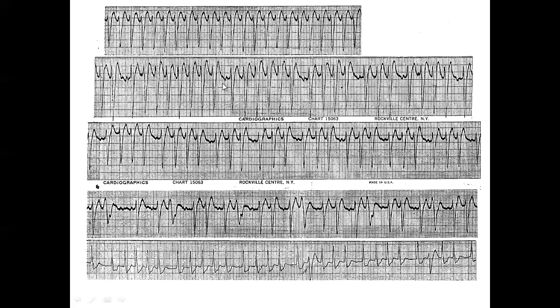It can do it for 6 beats, but couldn't do it anymore. It could do it for 4 beats and couldn't do it anymore. And it's manifesting as a Wenckebach phenomenon, and we can call it Wenckebach phenomenon because of the two earmarks. That is, among the group beating, the first one is always slightly longer than the others, and you cannot put two of these in here. Good earmarks of Wenckebach phenomenon.